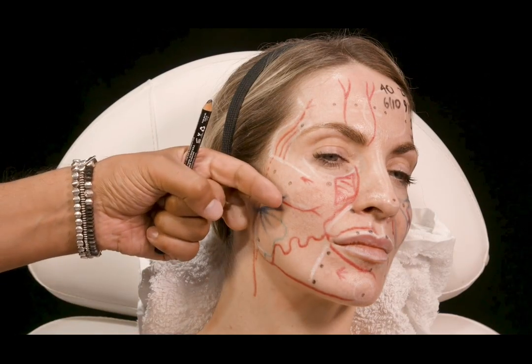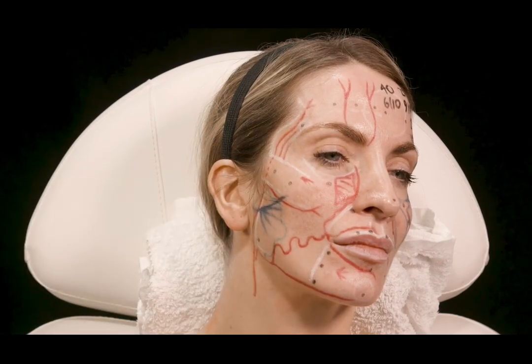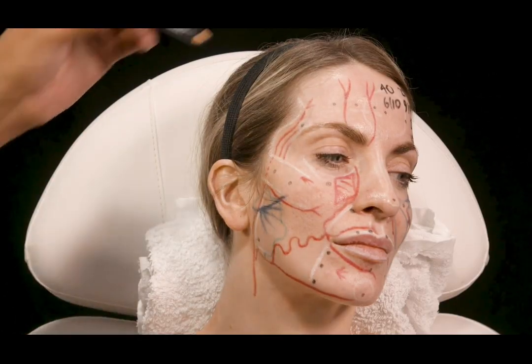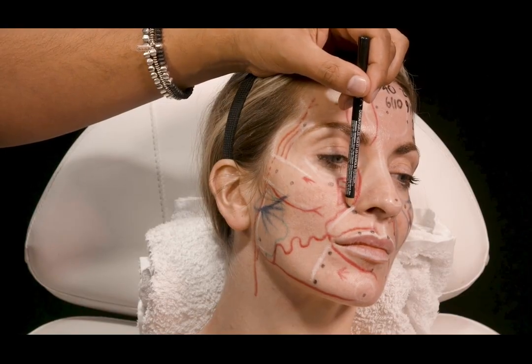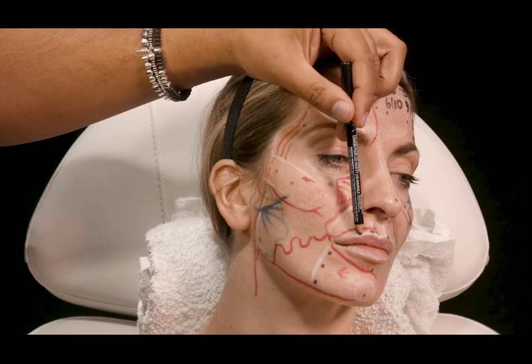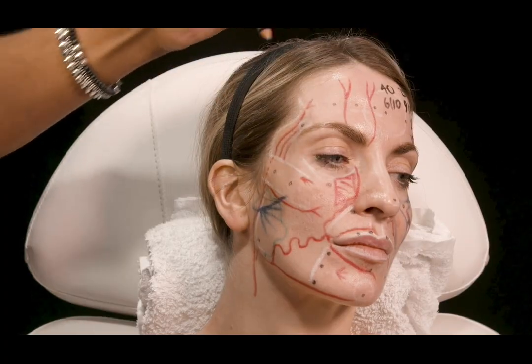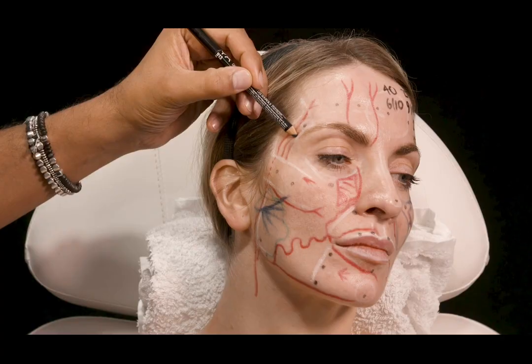So what would I suggest if you were going to inject here into the subzygomatic region, technique-wise? Cannula, right? Cannula is the go-to intervention for that region. When we inject, there's only 1 millimeter sometimes between safety and danger. 1 millimeter of depth, safety and danger. Also, not too far away here from being dangerous territory.